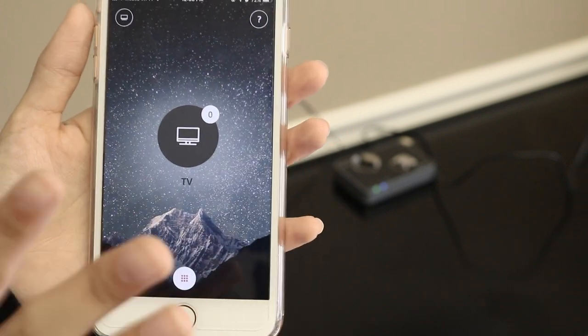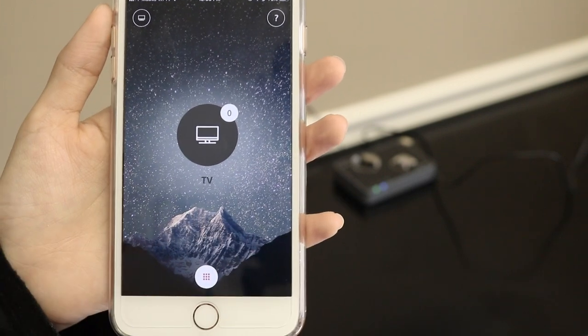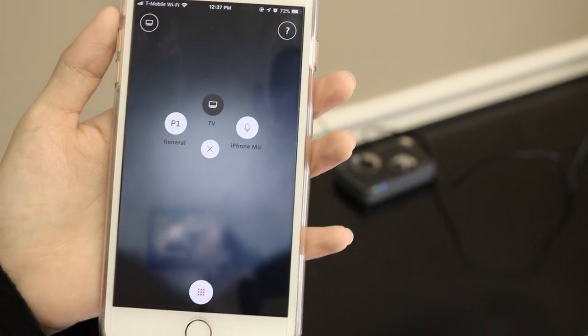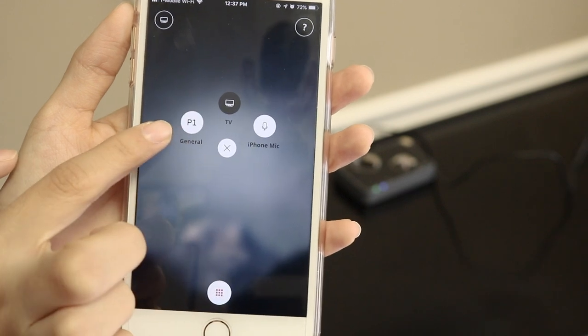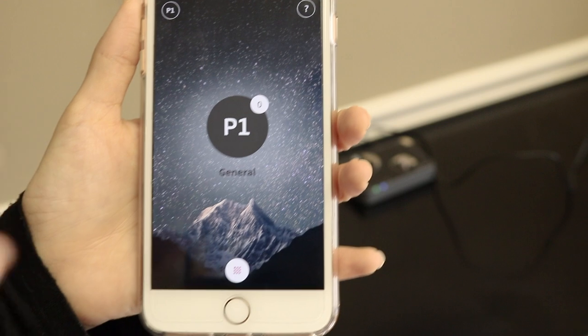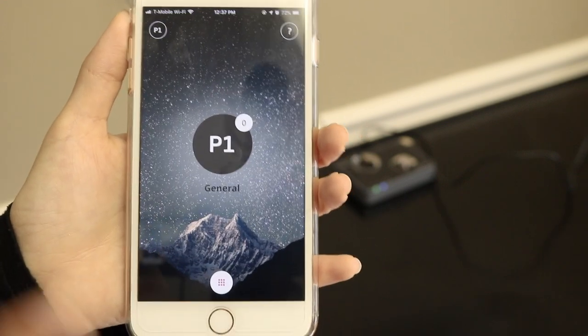If you want to leave the room and you no longer want to hear the TV through your aids, tap on that middle one again and go back to P1, and then you should hear regular sounds through your hearing aids and not the TV. And that's all there is to it.